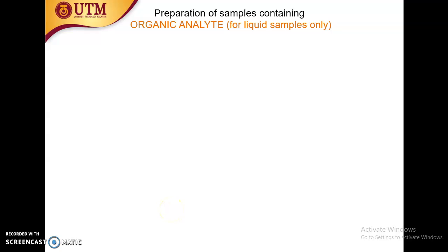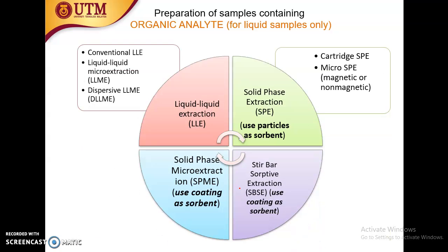We now go into the slide discussing how we want to prepare samples containing organic analyte for liquid sample. Same as what I gave you for digestion before, and also solid liquid extraction. The same diagram we showed you. We have like four like this. Okay.